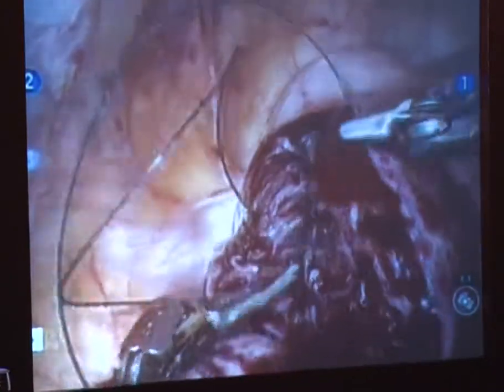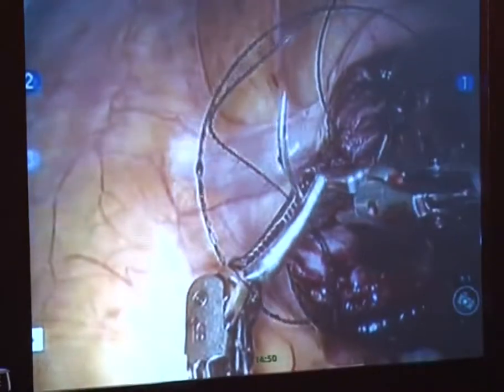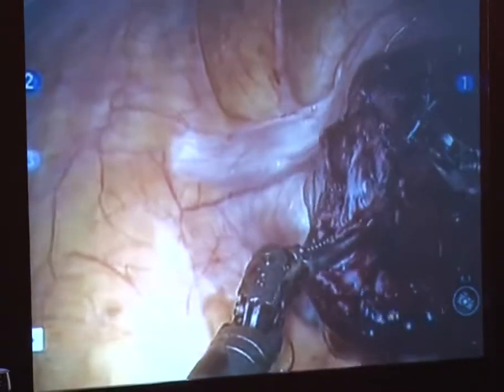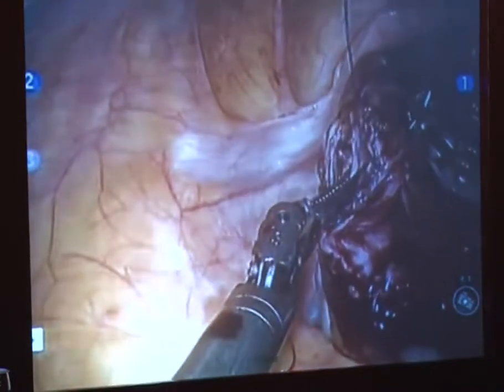I'm trying to orient my camera in a way that makes it seem as if this is a horizontal incision, even though it's not, just to make it easier for me to do the closure. And I'm running it, bringing it out just beneath the serosal edge, so that it'll almost kiss the serosal edges, or at least bring them together without a lot of tension.